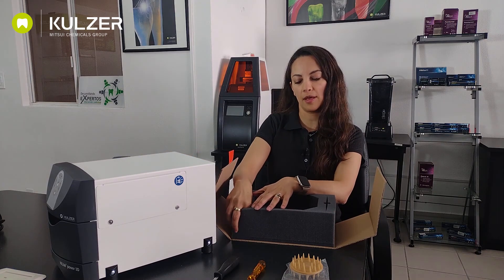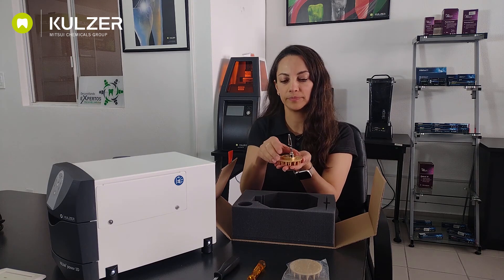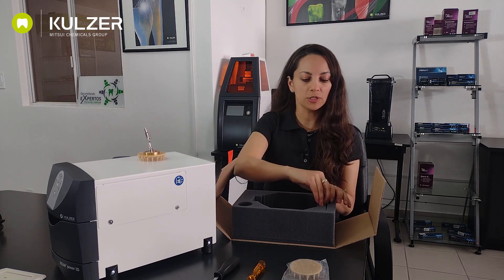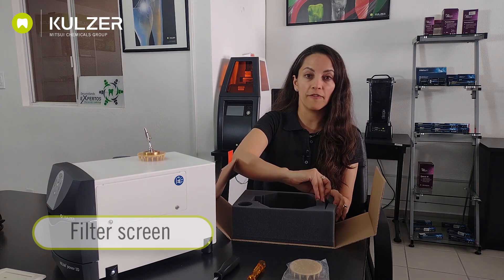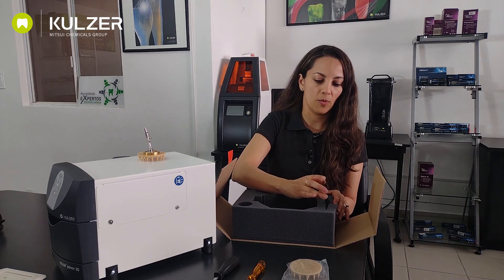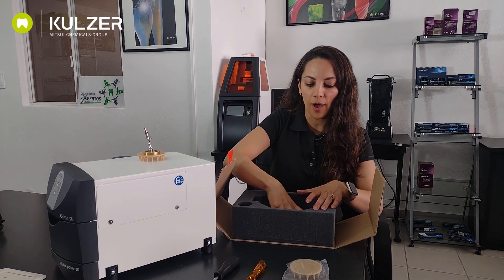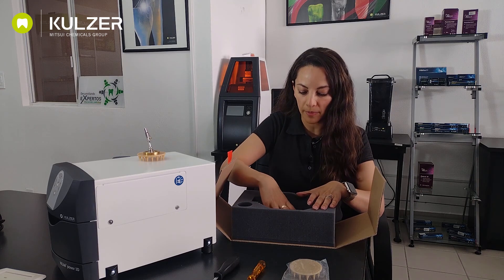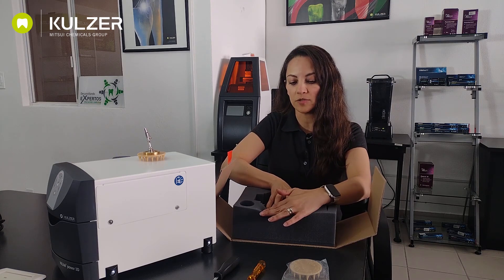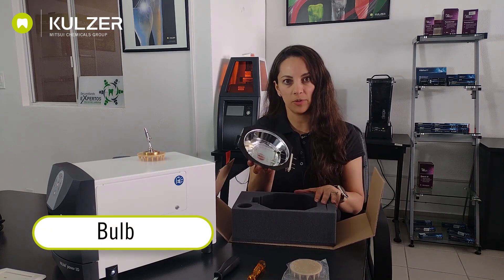We have the alligator clamp. The alligator clamp will be placed above the platform. Remember, always the spikes facing down and this will hold the work. We also have here the filter screen which you can see. Now remember to never touch the bulb with your bare hands — you have to always grab it by the metal. So let's do this very carefully. And this is how it looks.